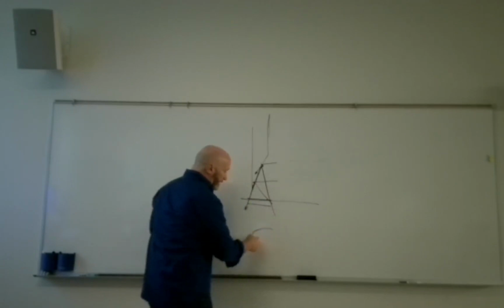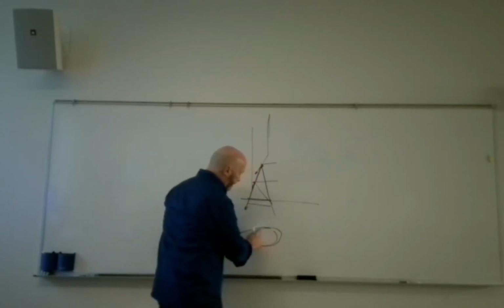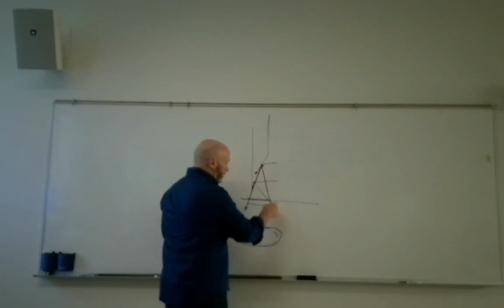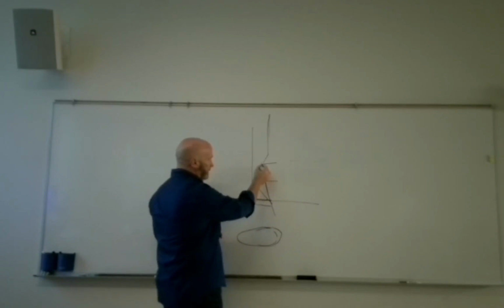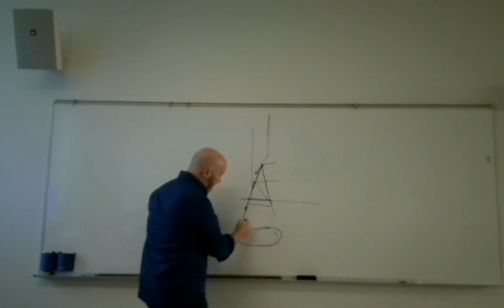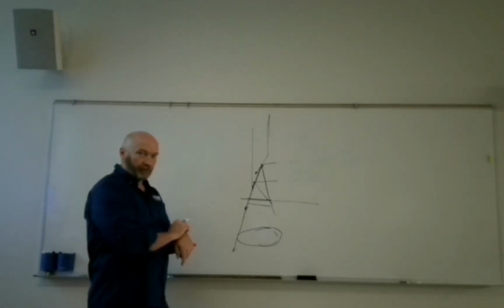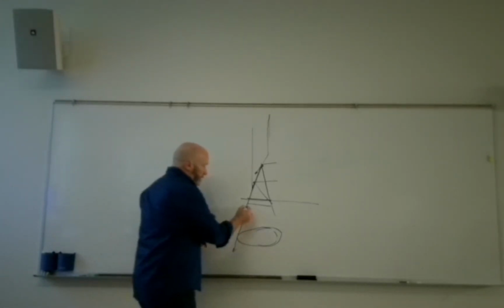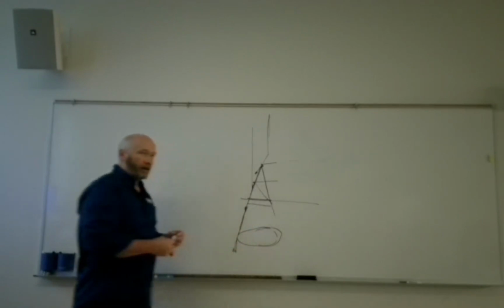So let's say we put a patient's anatomy, patient's too small, so we put the patient's anatomy right here. So what that means is that we're going to create X-rays that come off of this portion of the anode, this portion, this portion, this portion, all the way down, so that it's going to catch the edge of the anatomy and give us a density on our image receptor right there. You with me so far? We're also going to create some, they're going to hit it, and they're going to give us a density right here. Okay?